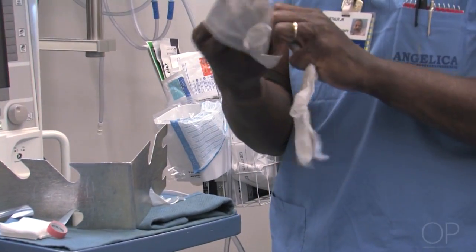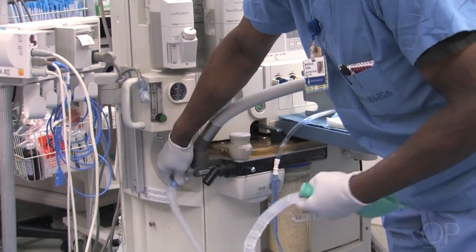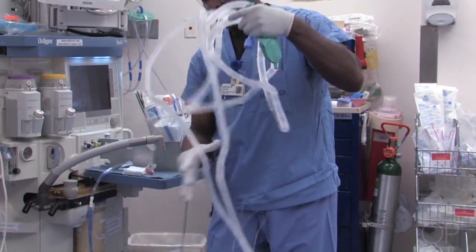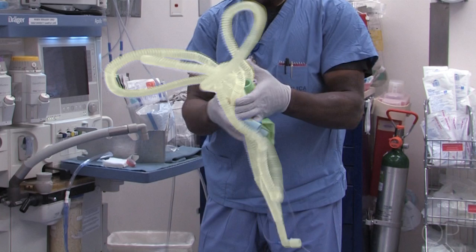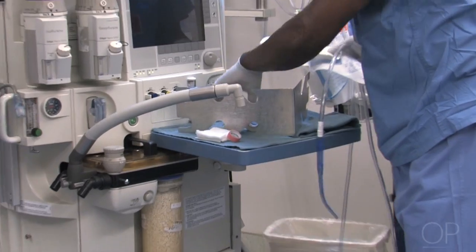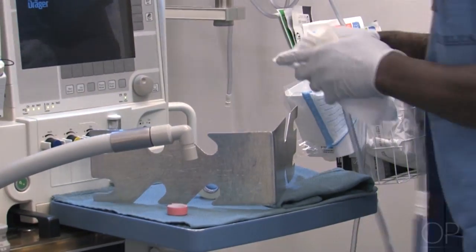The first thing we do is put on a pair of clean gloves. We start by disposing of anything that is disposable — beginning with the anesthesia circuit, then the suction, and anything else that is truly disposable.